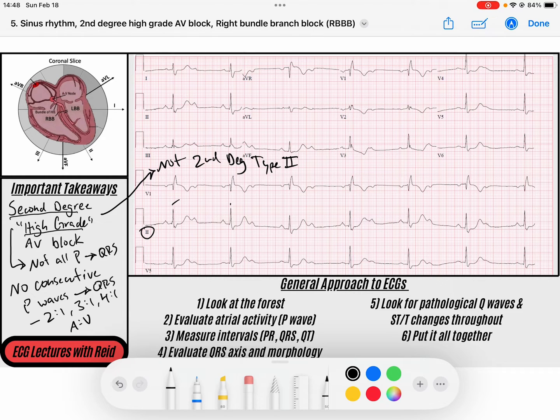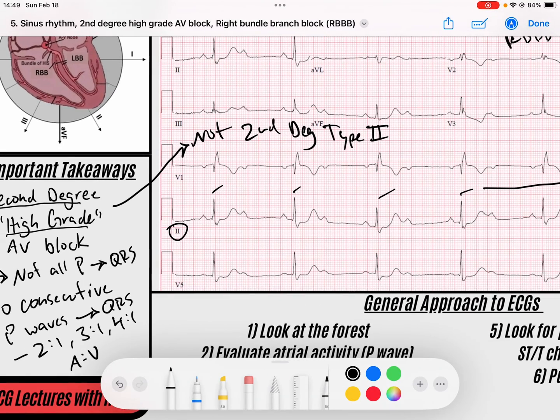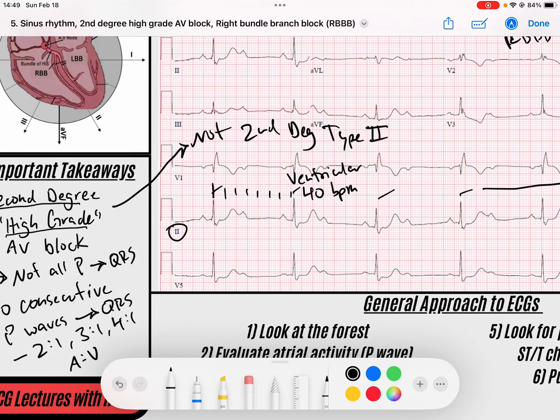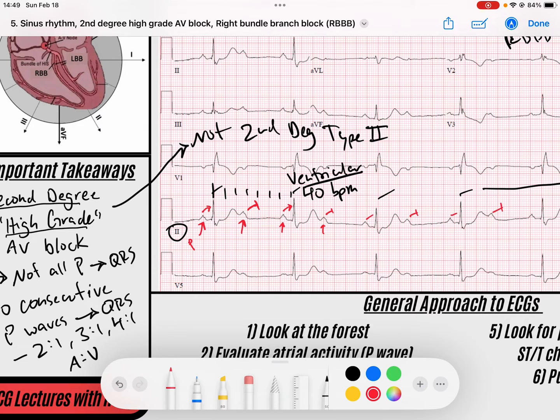Looking at lead 2: the rhythm is regular. You'll notice it has a right bundle branch block — we won't discuss that here. The QRS complex is regular and slow. The ventricular rate using the 300-150-100-75-60-50 method comes out to about 40 beats per minute. And if you notice, there are P waves where one conducts, one blocks, one conducts, one blocks — consistently throughout the strip. There are two P waves per one QRS.